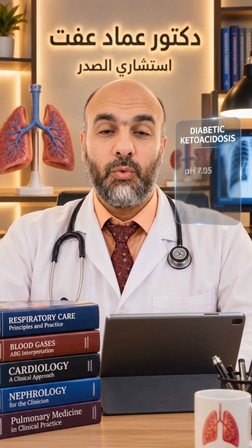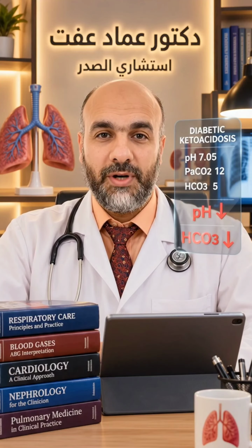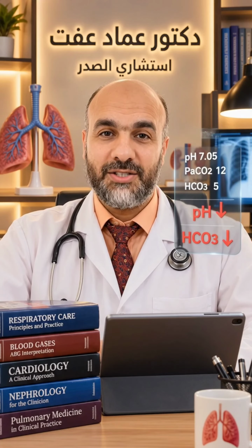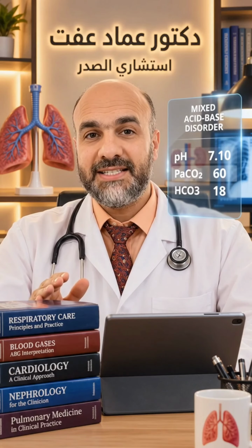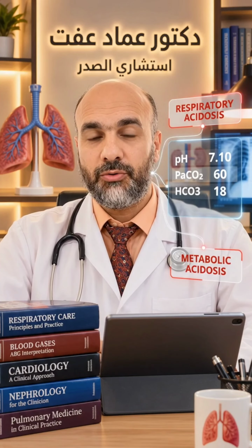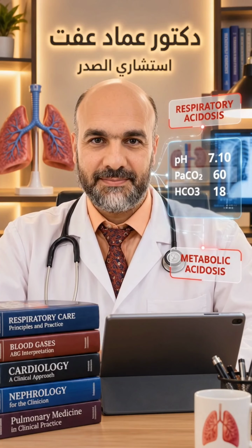Severe acidemia with very low HCO3. This is metabolic acidosis. Low pH, high PaCO2, and low HCO3. This is a mixed respiratory and metabolic acidosis.